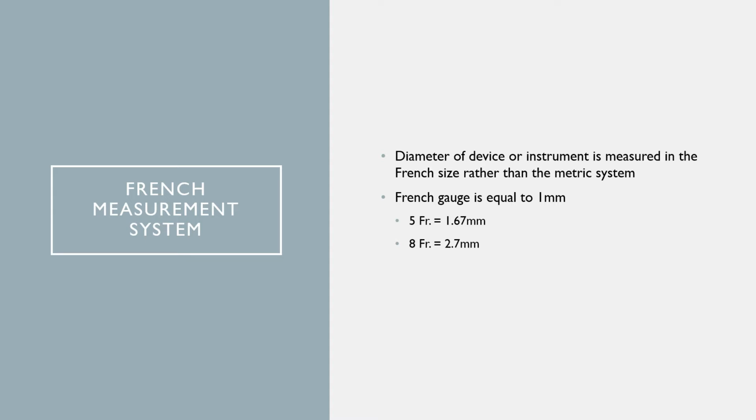It is very rare that you're going to have to do any kind of conversions. Usually our doctors know exactly what they need. It will be listed on the preference card as well, and they're pretty consistent from case to case. So when your doctor is asking for something, he will ask for it by French, and that is how the packaging is labeled as well.